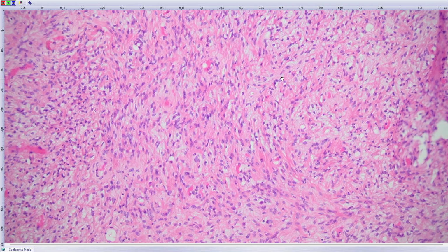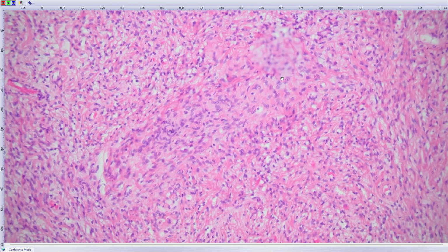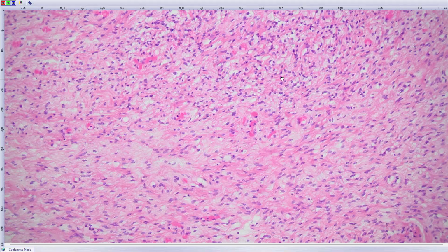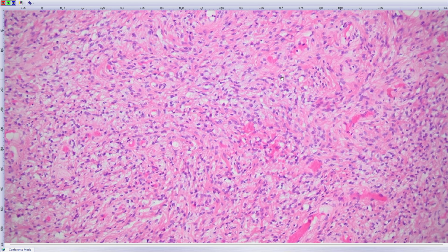Do you see this? Does it look like some other tumor elsewhere? I will help you. The lesion is retinoblastoma protein negative. That means deficient of retinoblastoma protein. And does not these lesions look like spindle cell lipoma of soft tissues of the neck, called fat-free spindle cell lipoma, without fat, yeah?